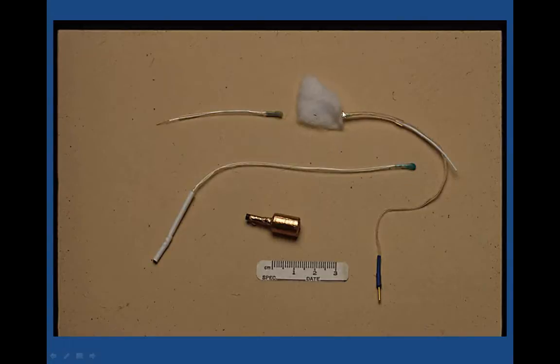This is a wick electrode described by Dave Lilly. I think some people continue to use this. It has to be saturated in saline and then placed into the ear canal. And it's a perfectly good electrode, but we found it kind of problematic at times that it tends to dry up and you have to keep saturating it with saline. It can disturb the recording process.